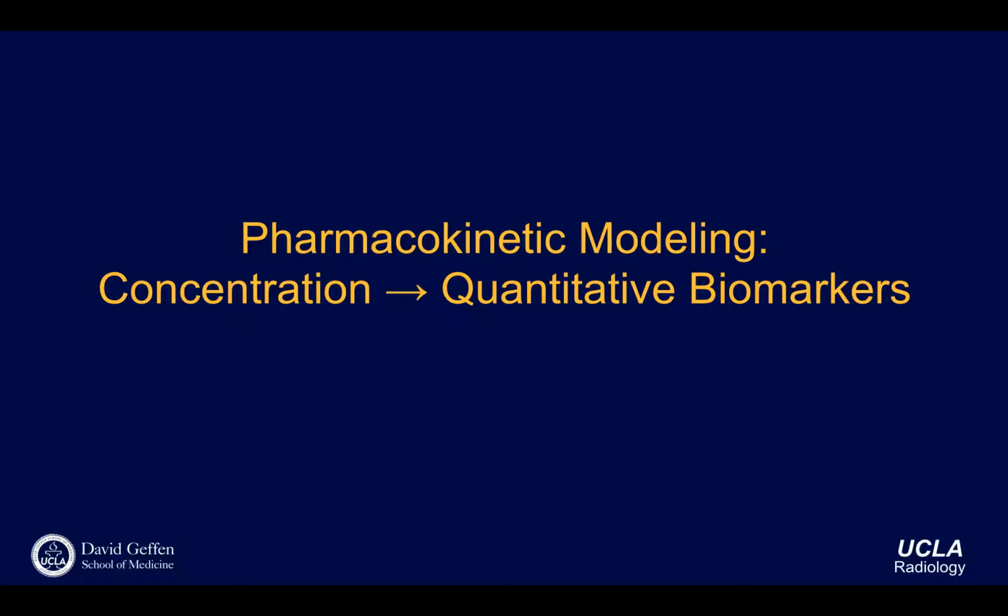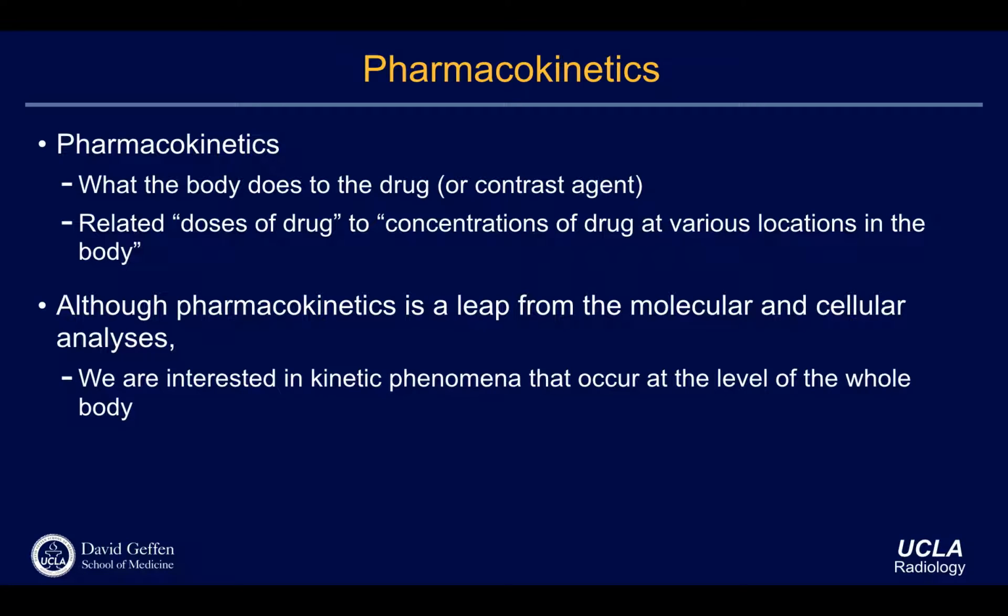Those are more quantitative imaging markers, like showing differences in a tissue status, okay? So this is basically you're assuming you know the CT of T, assuming everything is perfect, and you know what CT of T is, and then can you calculate those quantitative biomarkers, okay? So how do you do it?